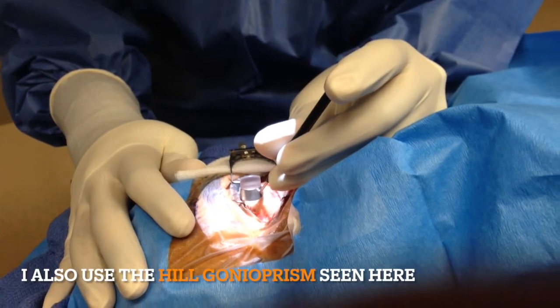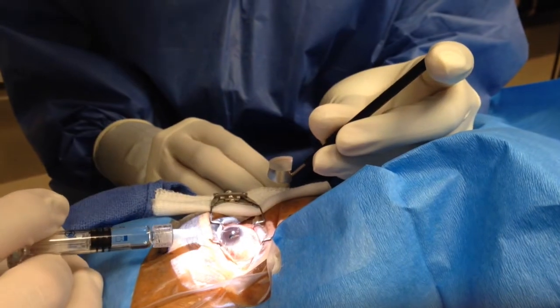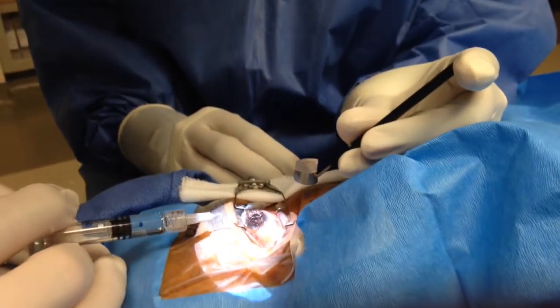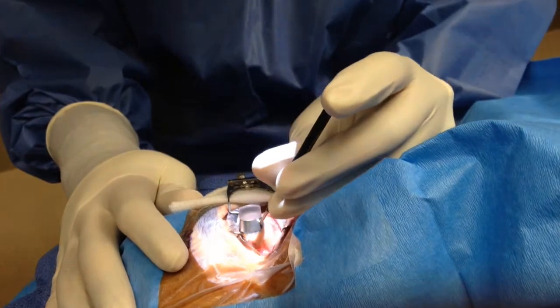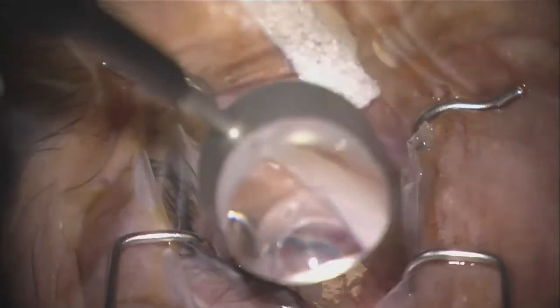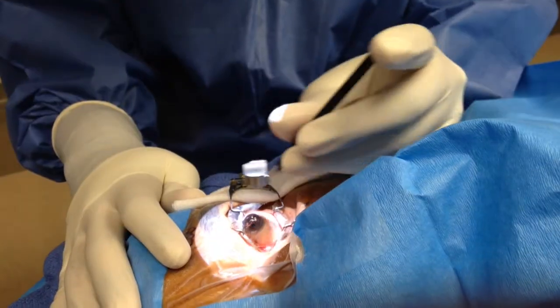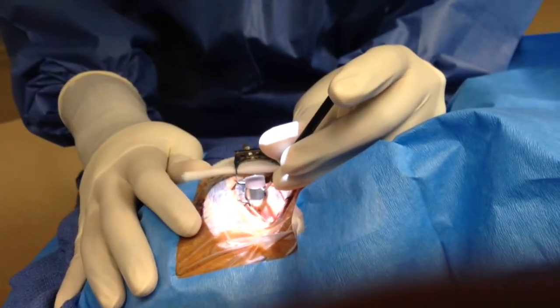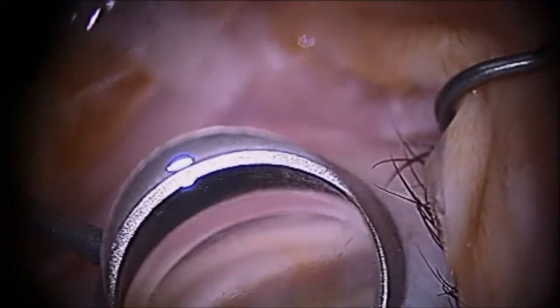The next key step is how you hold your gonio lens. The Swan Jacob gonio lens is held in the non-dominant hand, which may initially feel uncomfortable, so practice makes perfect. Before you lay your gonio prism on the surface of the cornea, make sure you are using enough viscoelastic on either the surface of the cornea or on the bottom part of the gonio lens. This will help with visualization. As you make contact with your gonio prism, you want to get a very good clear view. In order to do this, you cannot have too heavy of a hand, as applying too much pressure with your gonio lens can wrinkle the cornea, causing corneal striae and a poor view.